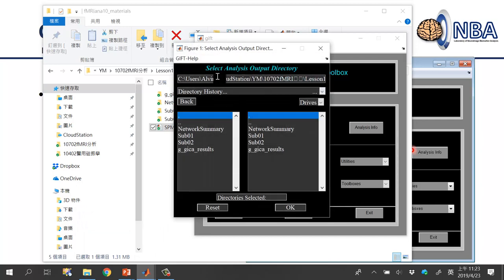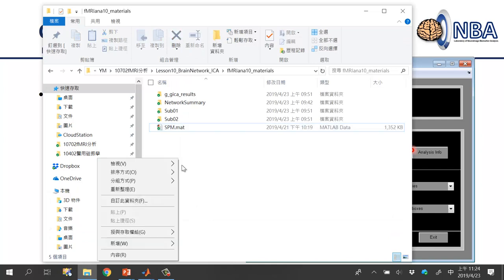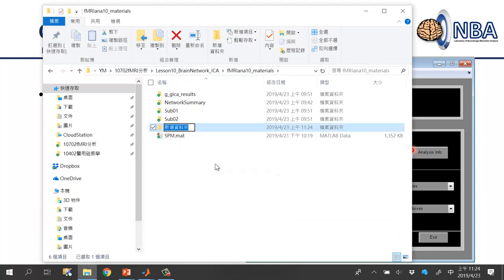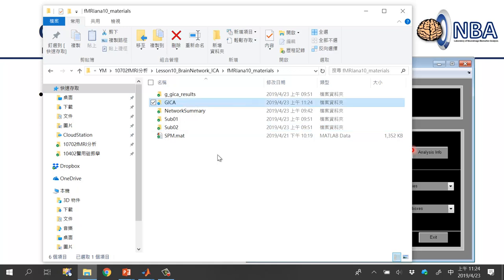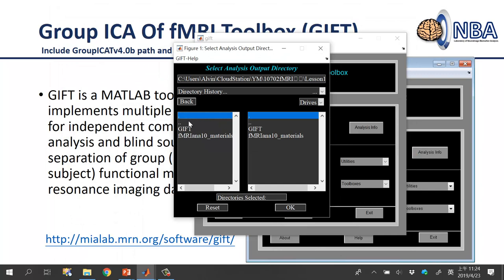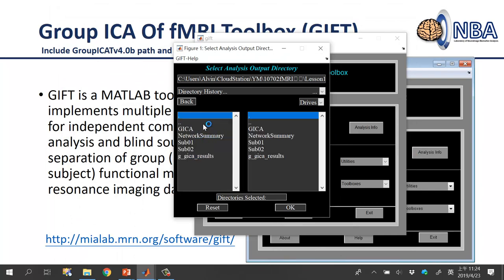First, it will ask you to select the analysis output directory. You don't need to specify subject data yet — just provide a folder for your results. Create a new folder, for example named 'gICA' or 'GroupICA', inside the fMRI Analysis Week 10 Online Materials folder. Select it and you'll see a '1' indicating one folder is selected.